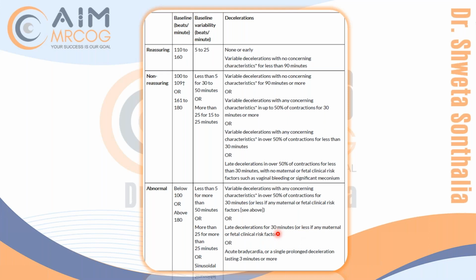So it's not like you see one late deceleration and you're like, oh, this is a late deceleration, I have to take off a section. No. Late deceleration for 30 minutes. Very important for you to understand this.